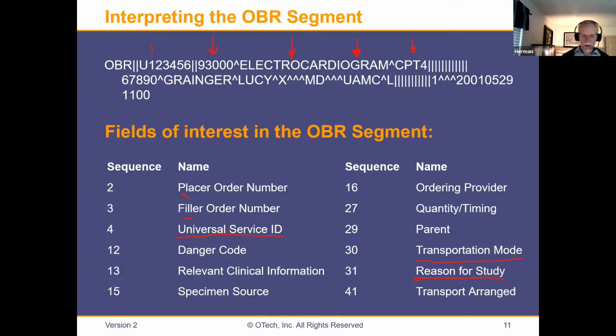Okay, so what we did so far is we looked at the HL7 messages. So we get a little bit of an idea of the information that is in these order messages. Now we need to map it in my worklist provider to a DICOM query response. And how does that work? Well, it actually takes a specification.